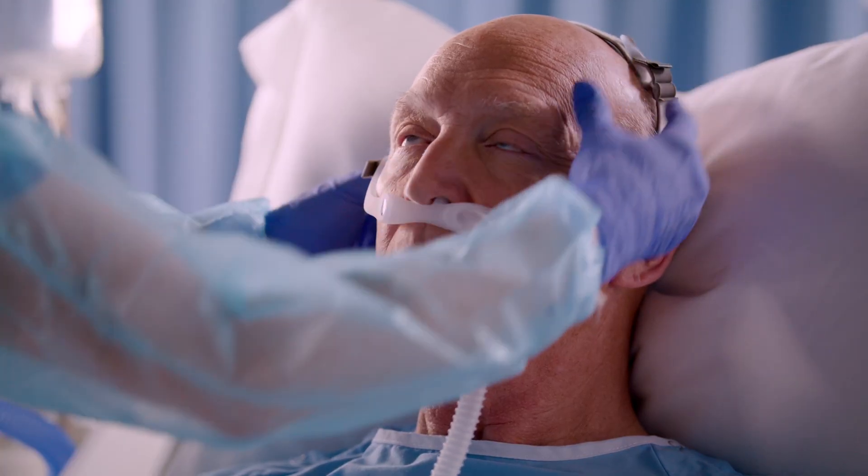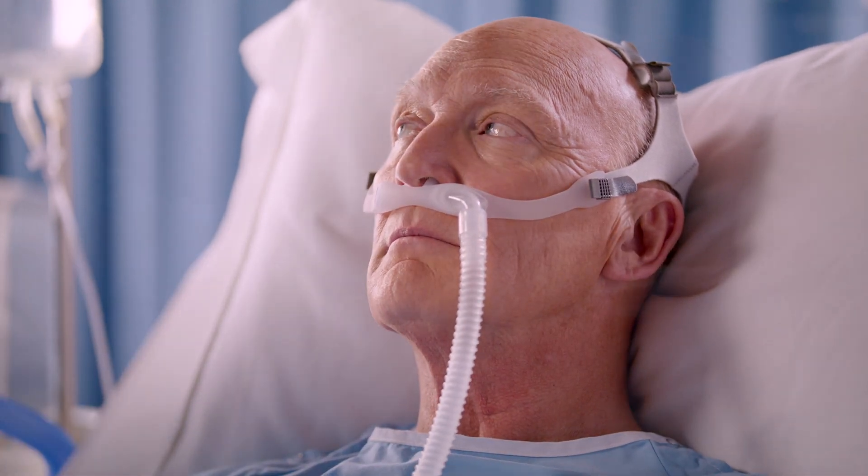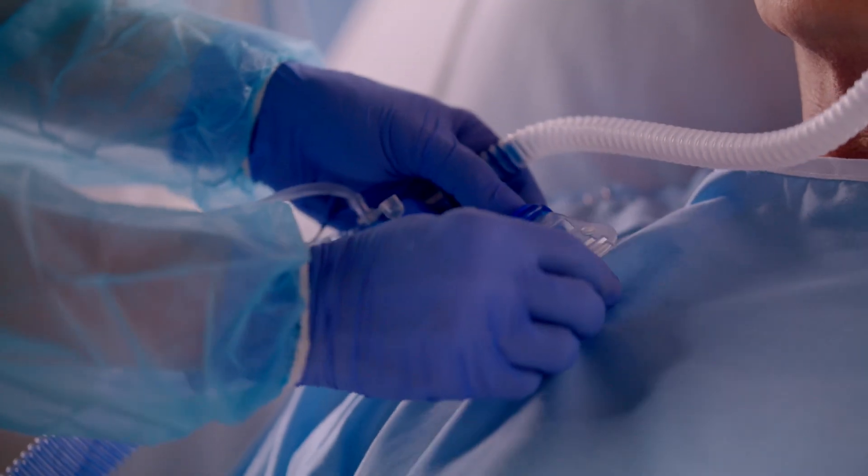Plus, the unique design of the AC611's adjustable headgear provides both stability and comfort. Its sturdy gown clip helps keep the cannula in place.